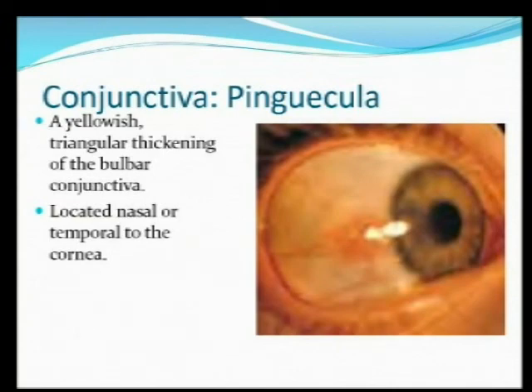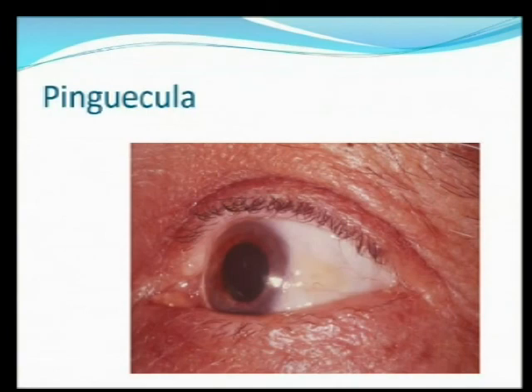From a contact lens standpoint, we'll look at this one right here. Again, notice how white the top part is above the triangle, and you can see you also got some elevation here. So no hard and fast rule on a pinguecula. If it doesn't appear to affect the fit of the lens, and during follow-up you don't see any irritation because of the lens, then it's probably not a problem.